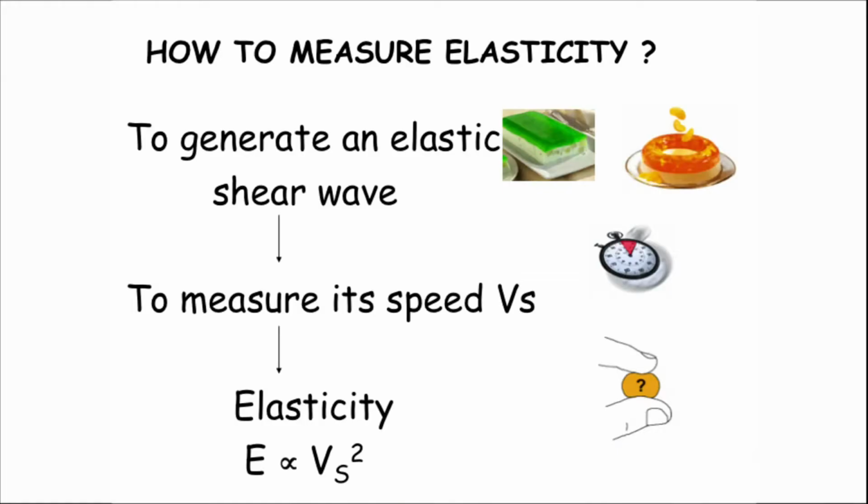The concept of elastography is very, very simple. What you do is you generate a shear wave within the liver, and then you measure the speed with which it travels through a predefined portion of liver. And the stiffer the liver, the faster the elastic wave travels through it. So, for example, if you've got a nice wobbly jelly, then it takes a longer time for the shear wave to move through the wobbly jelly. But if you've got a stiff bit of wood, then it moves through it very quickly.